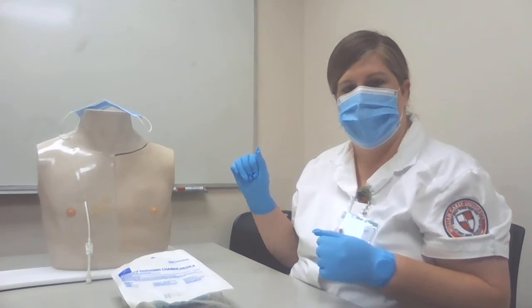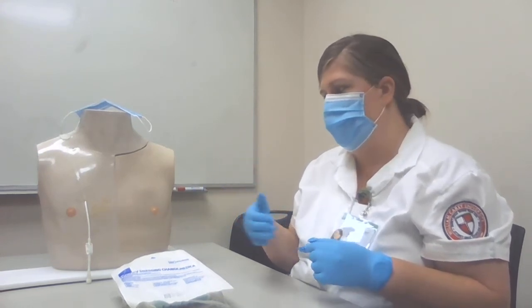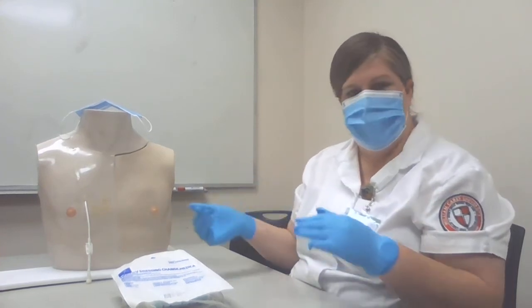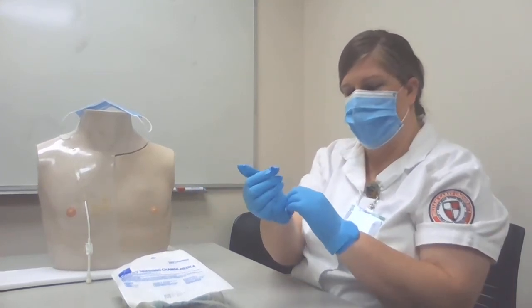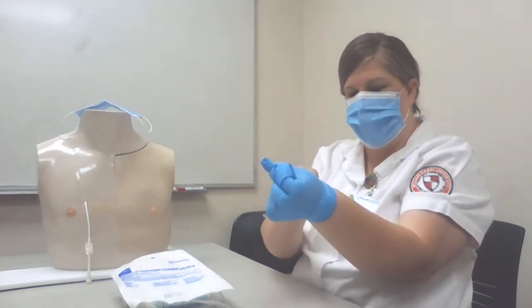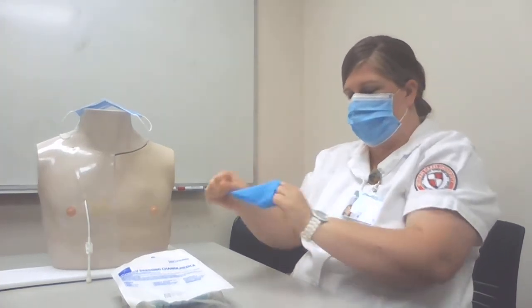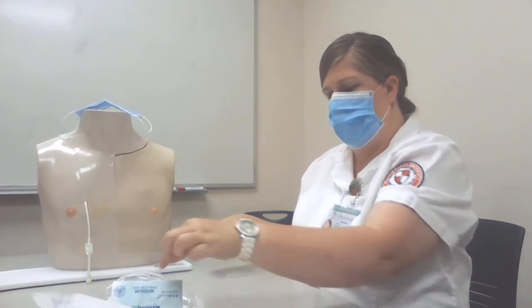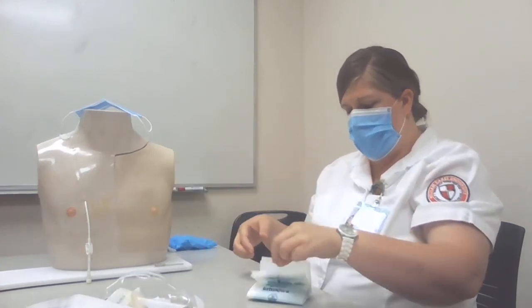So next I would assess the site for any redness, swelling, bleeding, drainage. If so, I'd document it or notify the doctor. I'd remove my clean gloves and wash my hands. And next I would get my sterile gloves and apply them.